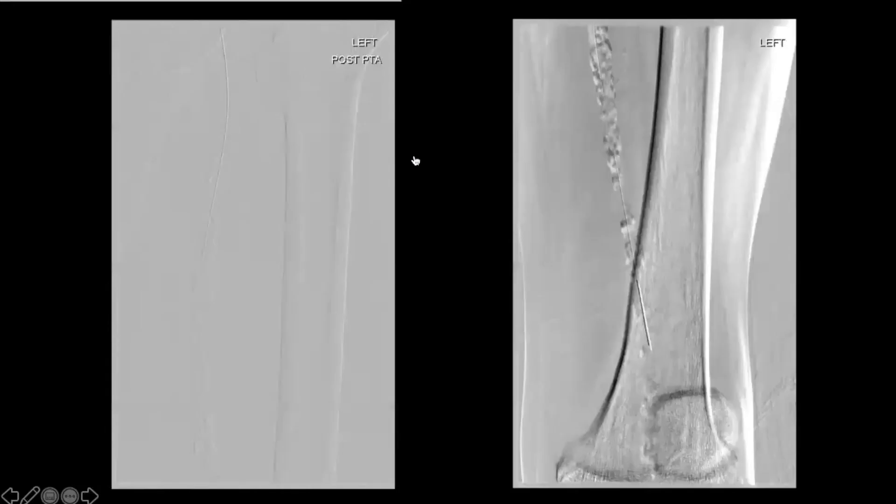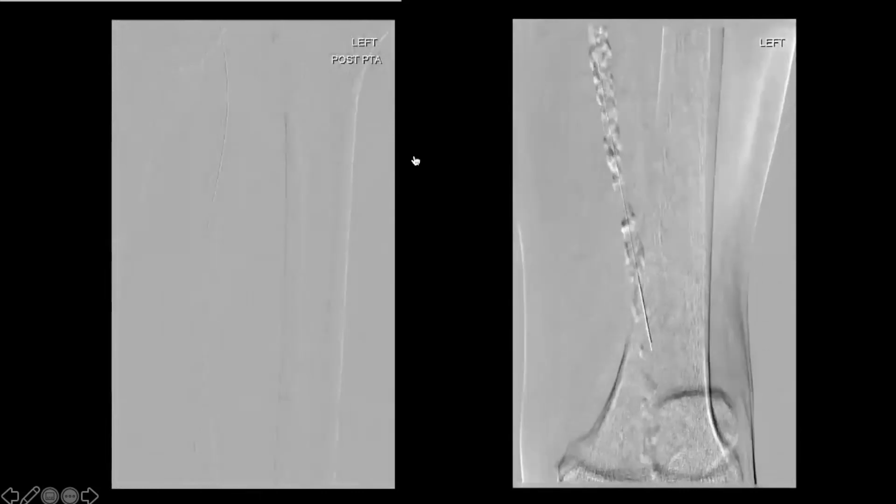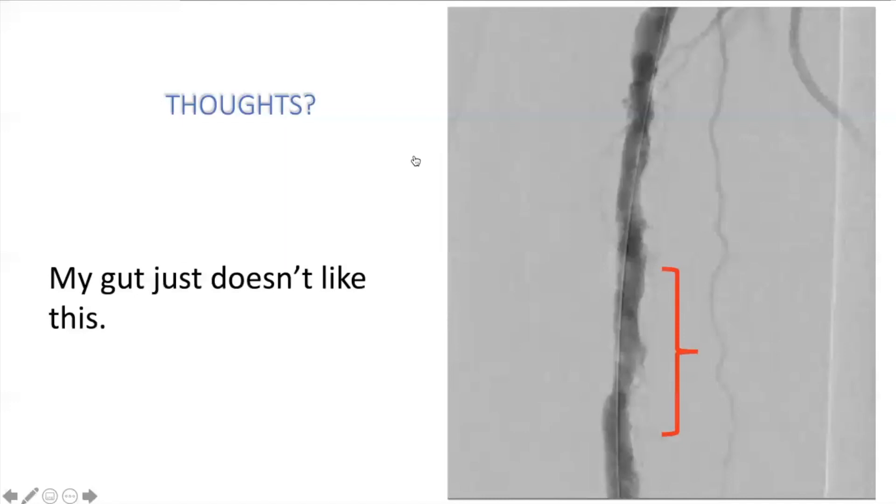Some general thoughts once you're across the SFA subintimally: you can see the wire pattern going subintimal. In this case you might consider orbital atherectomy. People ask whether atherectomy in the subintimal space is safe. If you know you're lumen-to-lumen and it's a short segment, it may help at the entry re-entry zone — that's where you tend to have recurrent stenosis. Doing a little vessel prep there may improve your outcome.